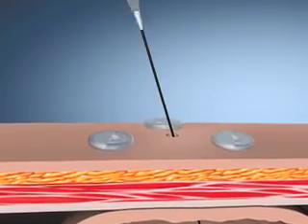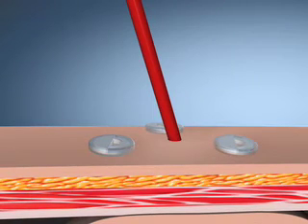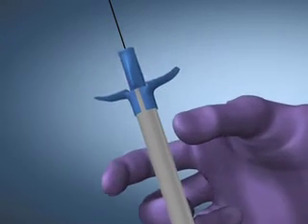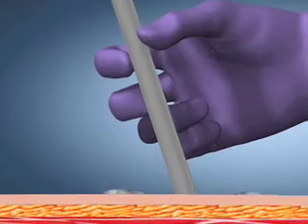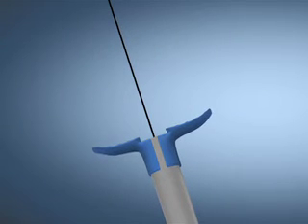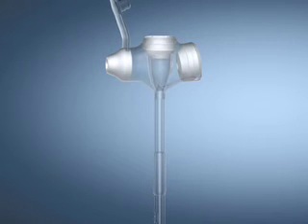Resume dilation by advancing the dilator over the guide wire, through the stoma tract and into the stomach. Continue dilation until all dilator sleeves have been advanced. Twist the dilator hub to release the peel-away sheath from the dilator. Lubricate the exterior of the peel-away sheath with a water-soluble lubricant and advance the sheath through the tract and into the stomach. Remove the dilator, leaving the peel-away sheath in the stomach, with the remainder securely maintaining position through the tract and exiting the stoma site. Select the appropriate Kimberly-Clark Mickey low-profile transgastric jejunal tube.